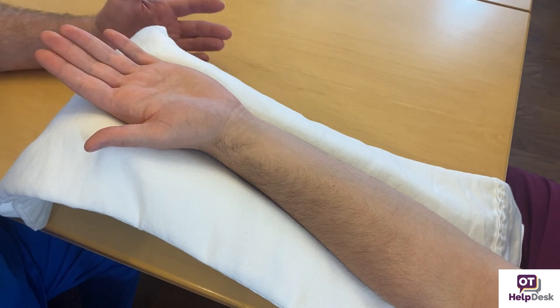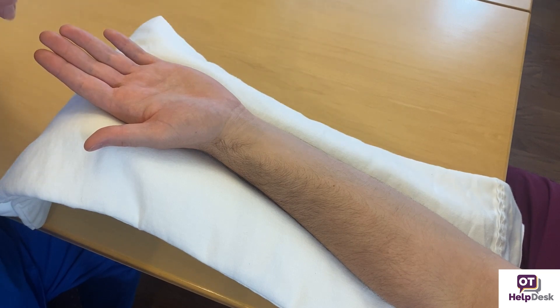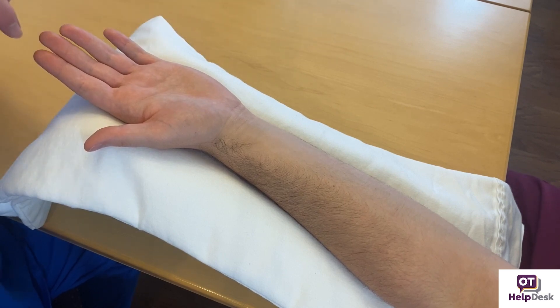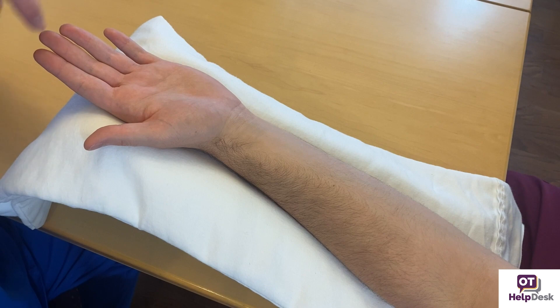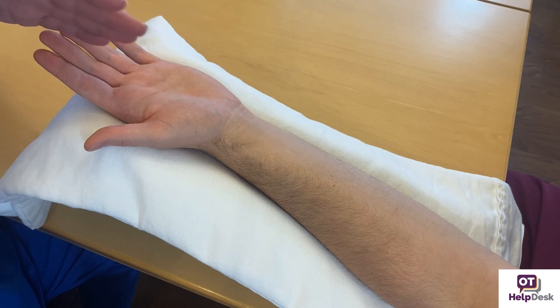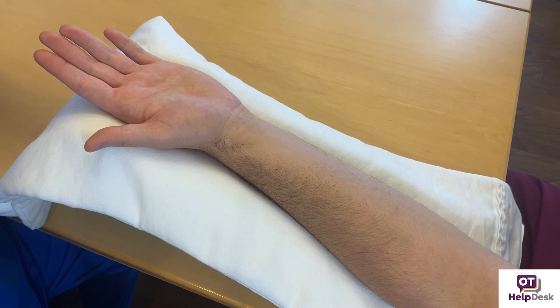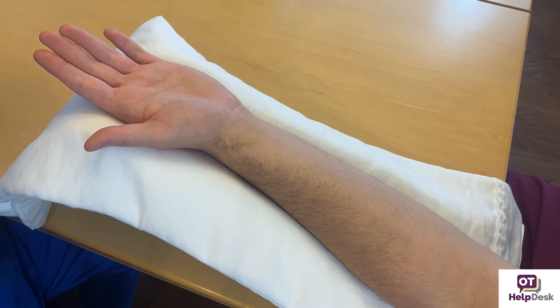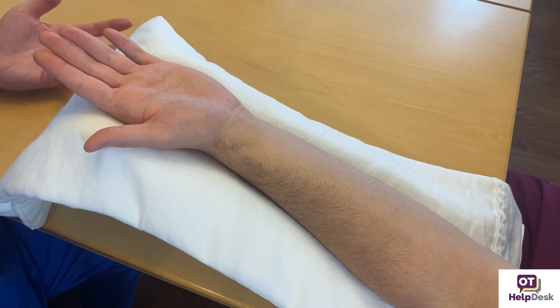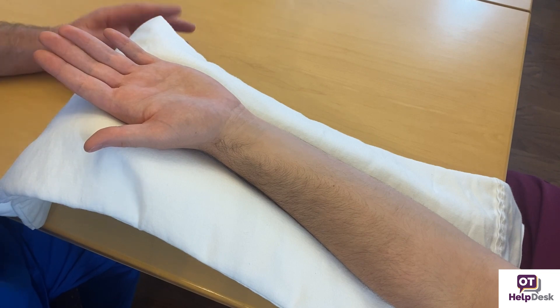When using this device, it becomes inaccurate if you're not alternating one point and two points. You have to mix them — otherwise you can't trust the response. If you're going to use this as a standardized tool, you have to do it exactly: ten applications on every finger, testing the way we just demonstrated.